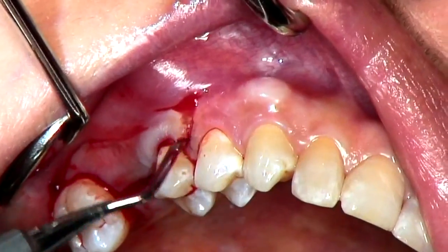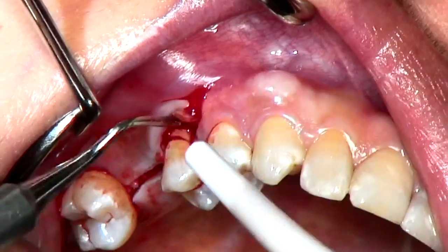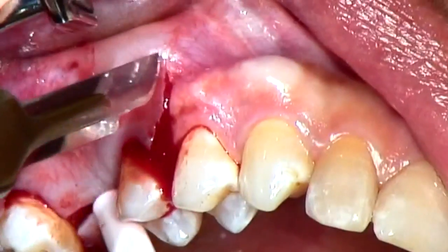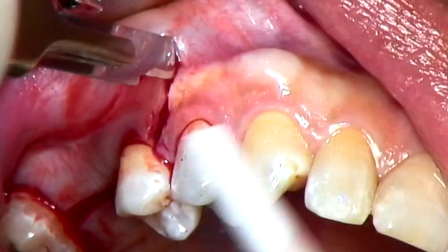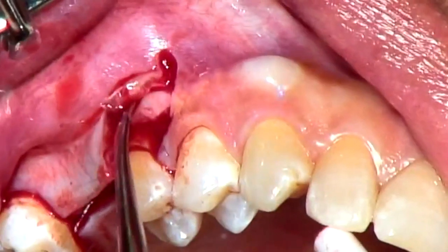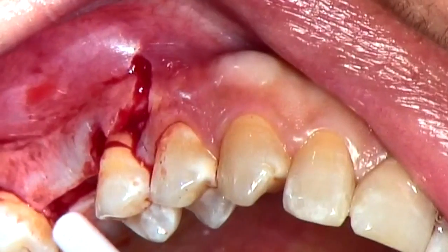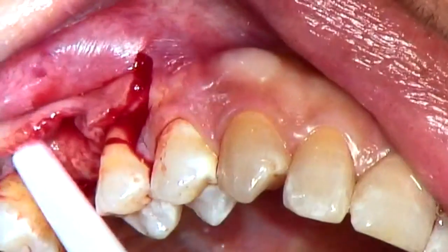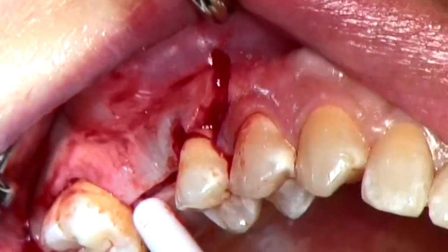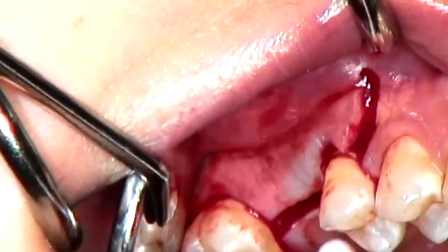This tip is very important — if it is too thin, it will necrotize after we suture the flap. So we want to bring it flat-to-flat here and as thick as possible. I will have to see how much will be enough for my release incision, and most likely I will need a small release at the distal side as well. I will place my distal release probably on the distal third of the buccal surface, not exactly around the corner.